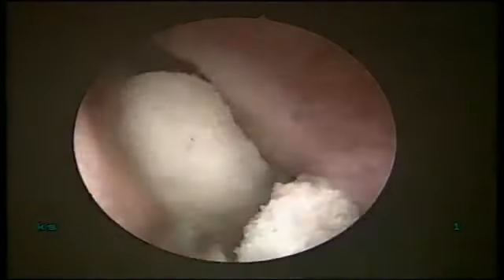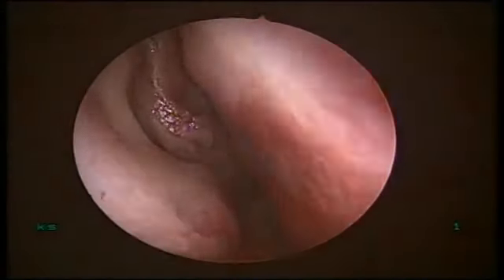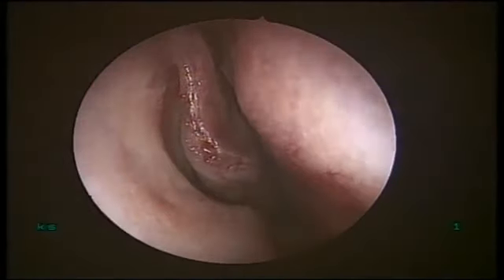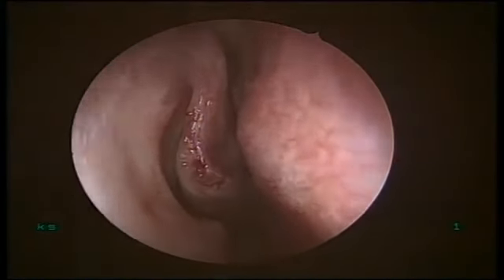So this is the right nostril, and this patient has chronic dacryocystitis, and our plan is to do an endoscopic DCR. Okay, this is the picture after decongestion. See, in the DCR, the area of interest.